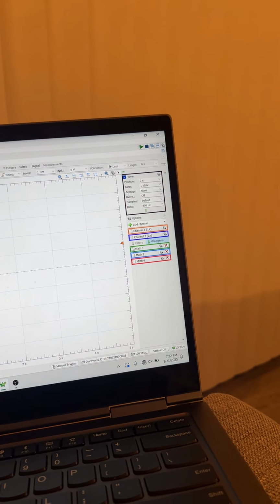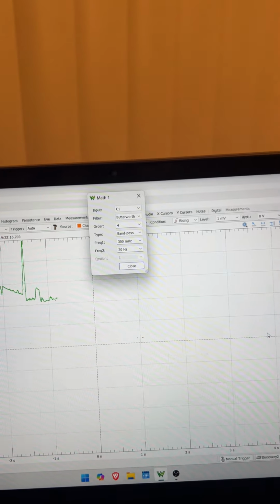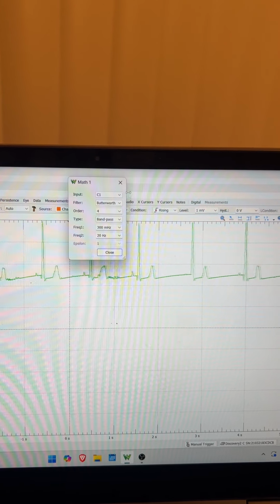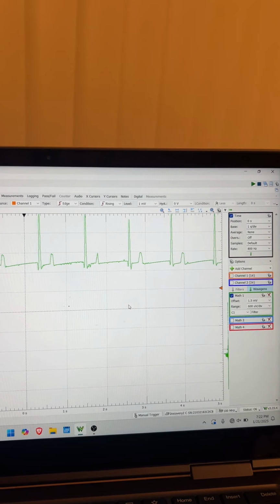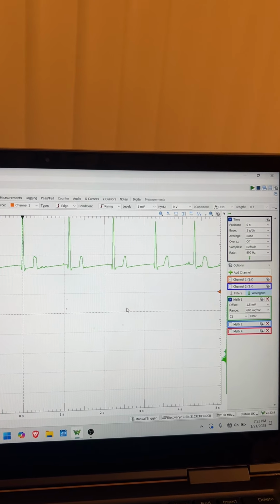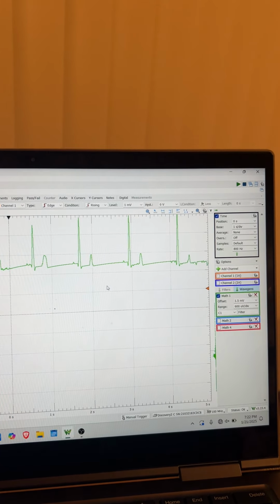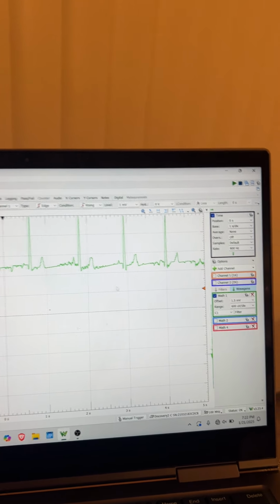In order to make this signal cleaner, I'm running it through a filter, specifically a Butterworth software-defined bandpass filter, which is limiting the frequency between 300 millihertz and 20 hertz, which seems to give a pretty good signal. As you can see here, there's still a little bit of noise that manages to creep through, but it's hard to filter out that noise electronically, because you can't filter out the frequencies for the noise without filtering out some of the really important signals from the heartbeat here.